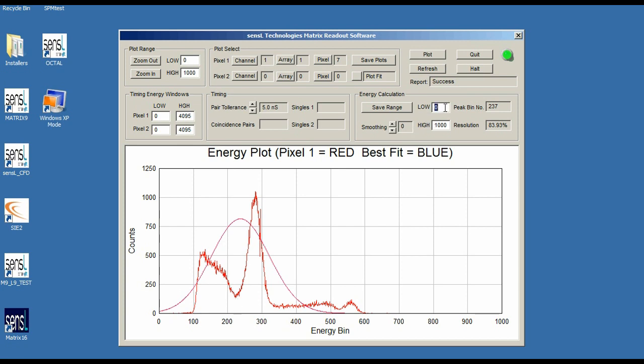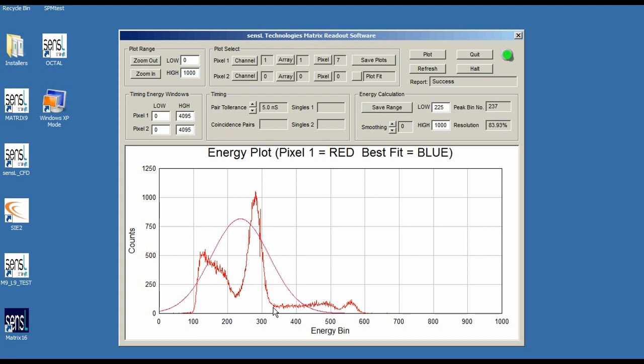That's about 225 on the energy bin. This is an uncalibrated energy bin, so don't be too worried about what the actual value is. You can calibrate that separately if you like. I'm going to put the high value here at about 320. You can see I'm going to change these settings so that I can bound my 511 keV peak and get a good fit.